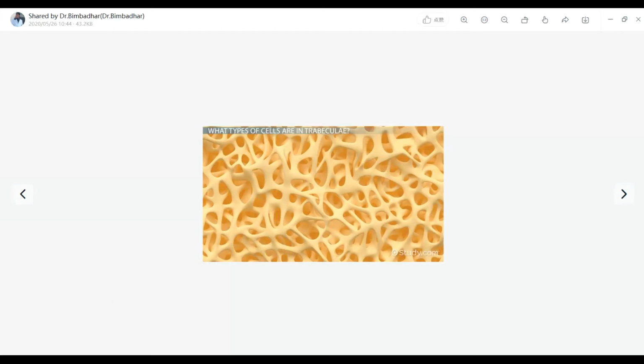So how will that trabeculae look? The trabeculae will look whiter, but still look thin. Did you understand this concept now? Apply the same kind of shadows we have learned from the checkerboard illusions, right? There is thinning of the trabeculae, but they will become more prominently seen. Yes or no?